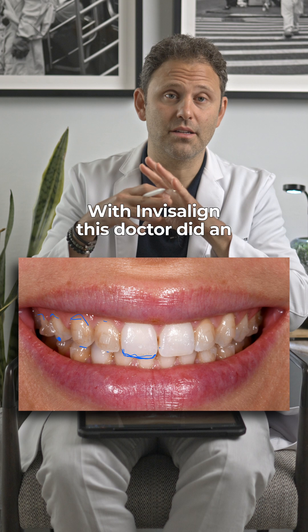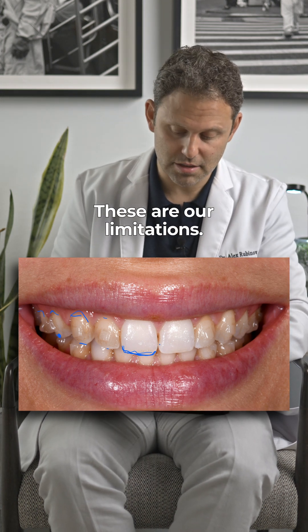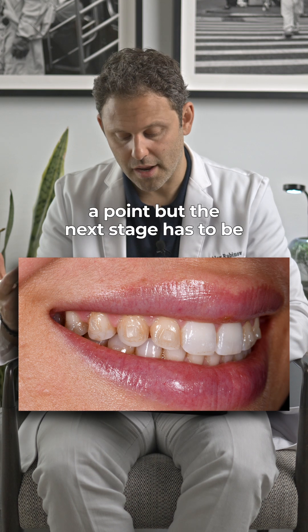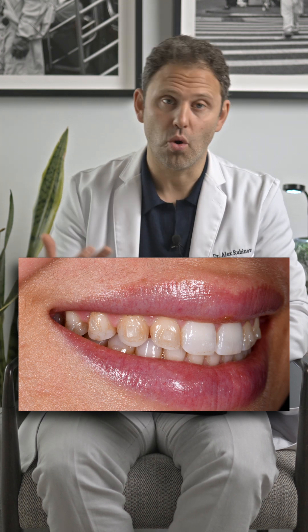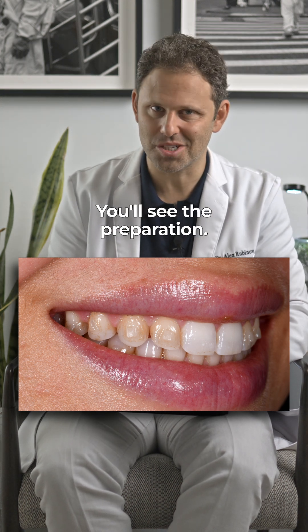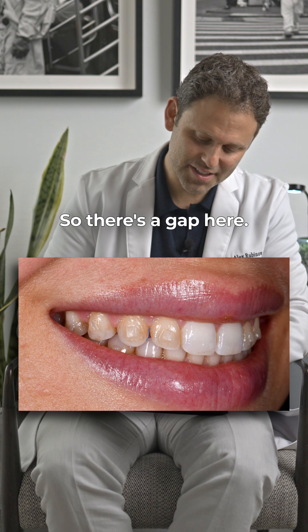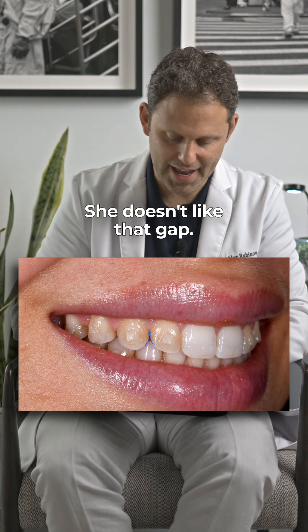With Invisalign, this doctor did an amazing job. These are our limitations. This will bring us to a point, but the next stage has to be something more invasive. You'll see the preparation. There's a gap here. Invisalign was completed perfectly, but she doesn't like that gap.